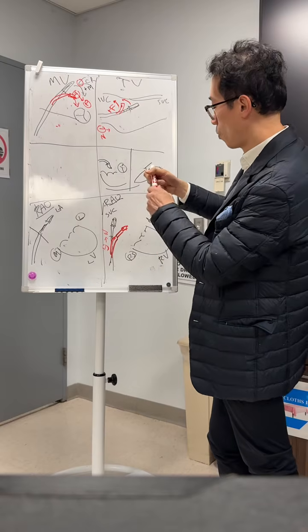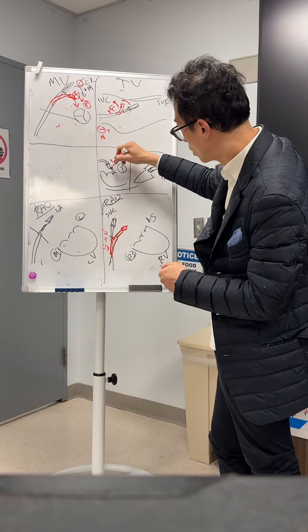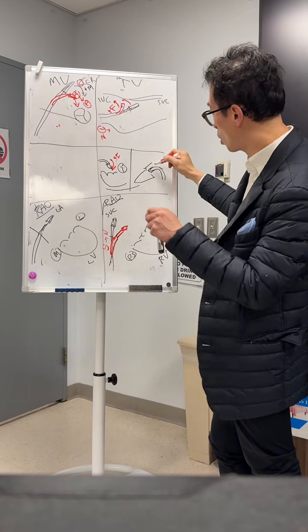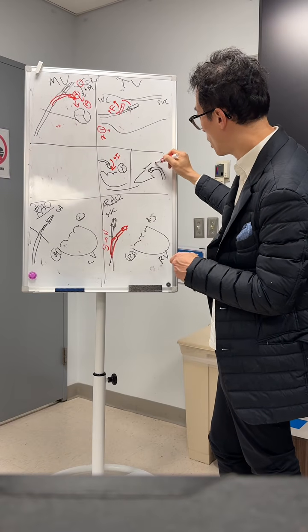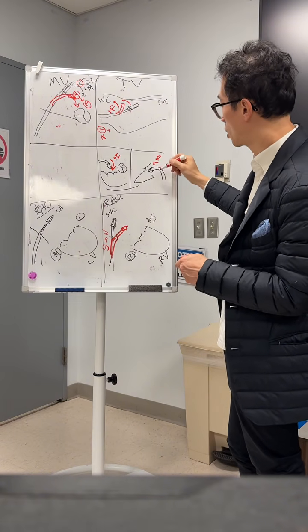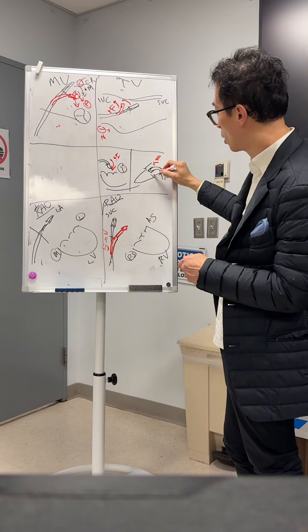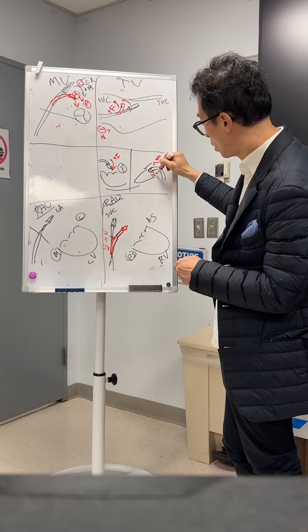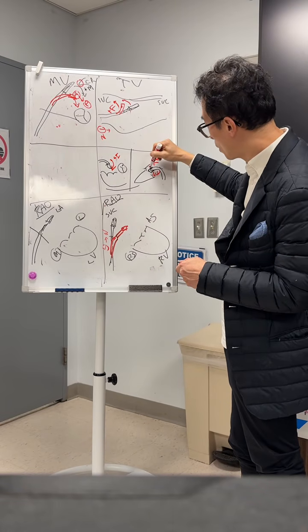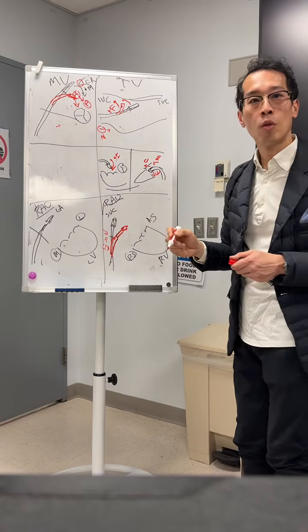So this is what's going on when you flex, and then when you counter clock, right, as you flex, and you counter clock the guy, you'll go more lateral, and if you clock the guy, you'll go more septal.